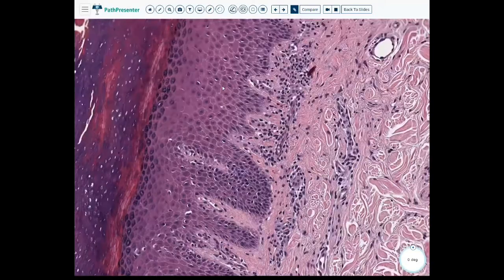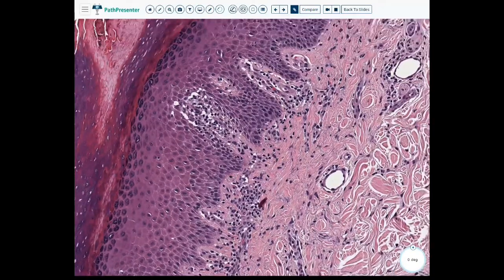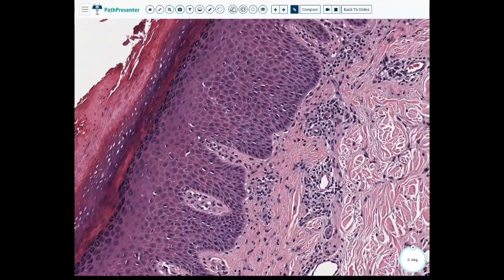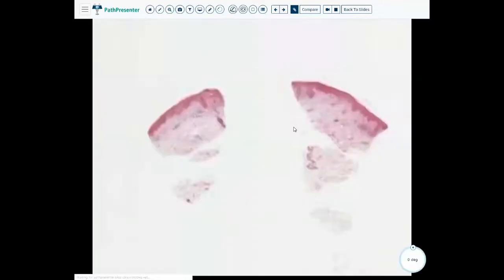It's not really a feature of this, but there can be multiple things going on in skin. So what this is representing is eczema. So we have acanthosis, spongiosis. We do have those microvesicles. This is an acanthotic lesion, or acanthotic eczematous lesion. So this is case 8.